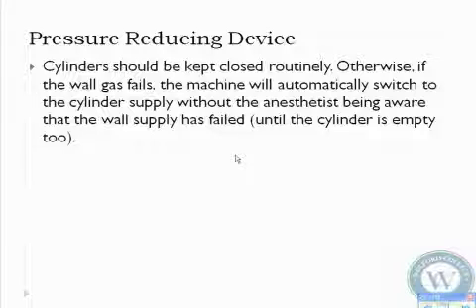But we always need to check that, and people don't check it routinely. I can guarantee you lots of people forget to check this in the mornings. And there's some people that have big pet peeves about this, and it's something that they'll always check. I can guarantee you I always check that. As soon as I walk in the room, I look at the pressure gauge just to see if they've been checked.